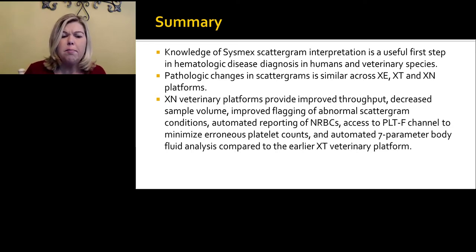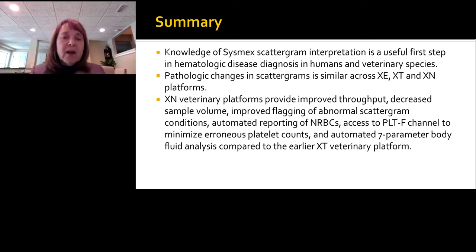Dr. Criswell, why is multi-species software necessary to accurate WBC differential discrimination? Okay, so I think we covered that in part of the presentation, but let me hit on it once again because it really is an important aspect. I will tell you, 20 years ago, people ran all their veterinary samples through the human-based hematology analyzers. And it took a while to recognize that they really aren't very accurate. So it's absolutely essential to use a veterinary software when you're reporting veterinary results.